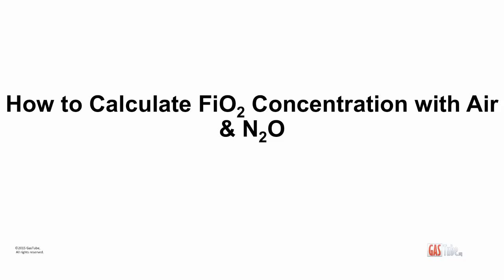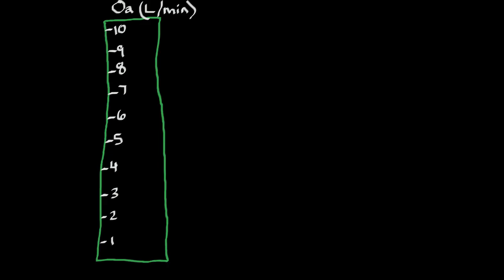Welcome to the video on how to calculate FiO2 concentration with air and nitrous. Okay, let's talk about flow meters. So here's our flow meter for oxygen in liters per minute.